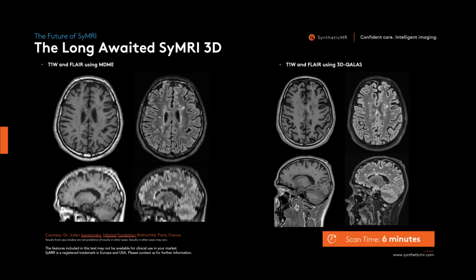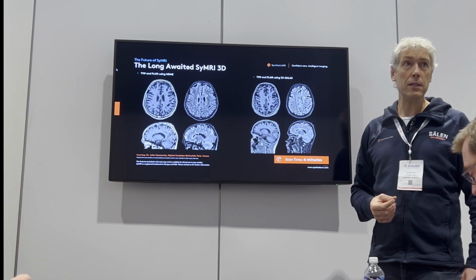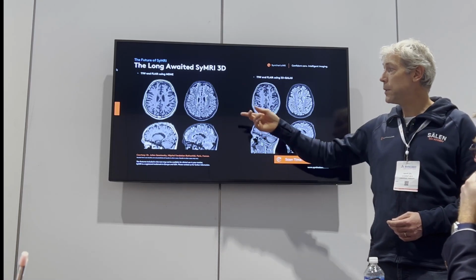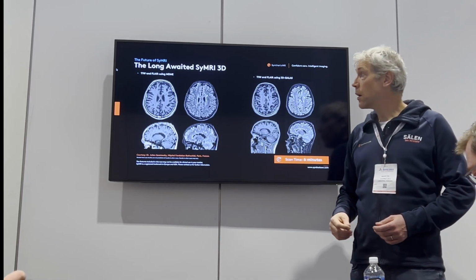Screen is not great, but at least I can show you the idea behind it. 3D, obviously. We have this solution today. It's a multi-slice turbo spin echo-based sequence. So typically we have 4mm slices, and they have a high resolution in plane. So you have about 30 slices covering the head, but you're not able to make some sort of reformat. That'll be a very low resolution.